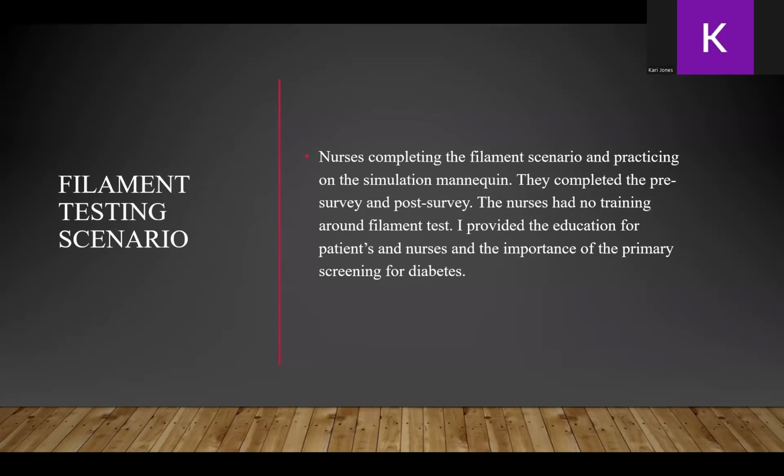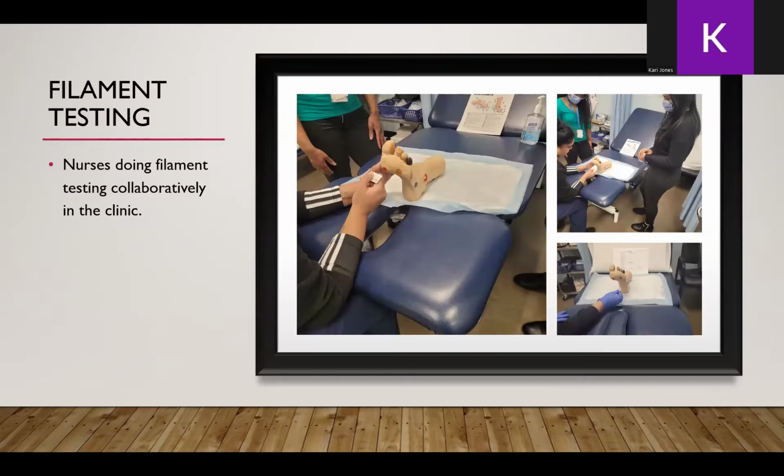Filament testing. I set up a scenario for filament testing, and we used the same mannequin's foot. She was able to do the sequence of filament testing. Because I am an advanced diabetic foot care nurse, filament testing is a must. So I was able to educate the nurses on how to actually do filament testing and have the patient close their eyes and locate where the filament is on their foot to determine if there is a neuropathy in that area or not.